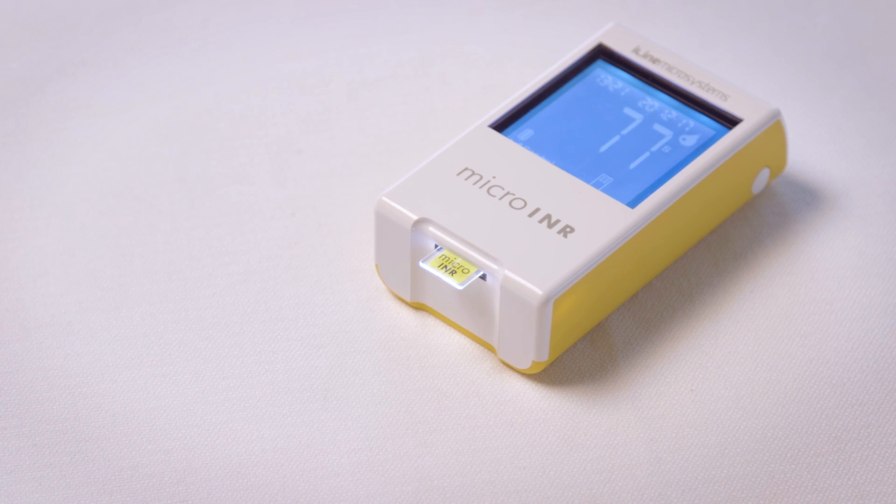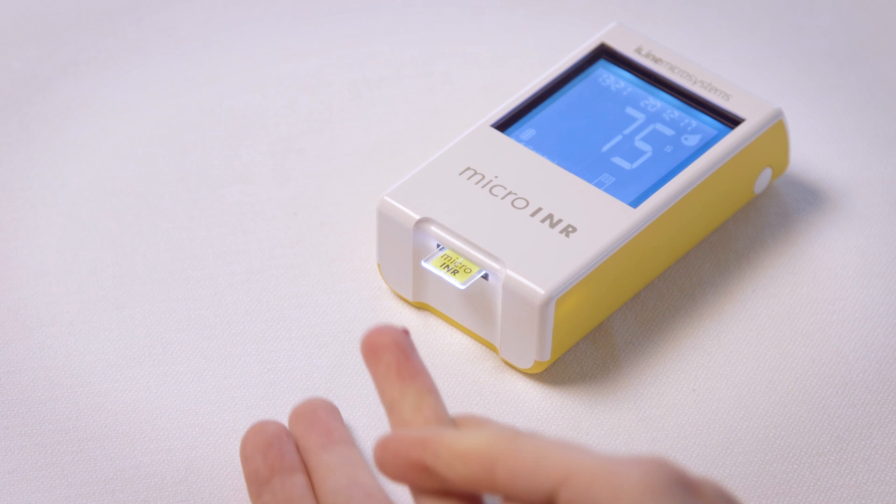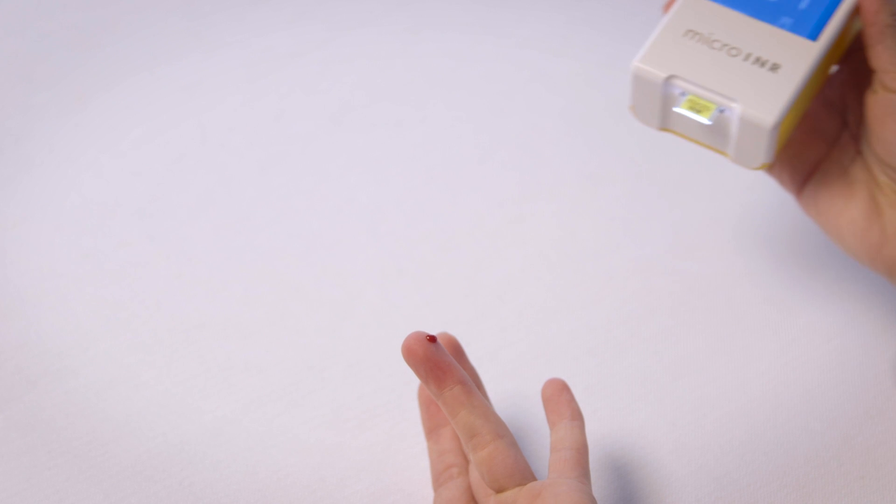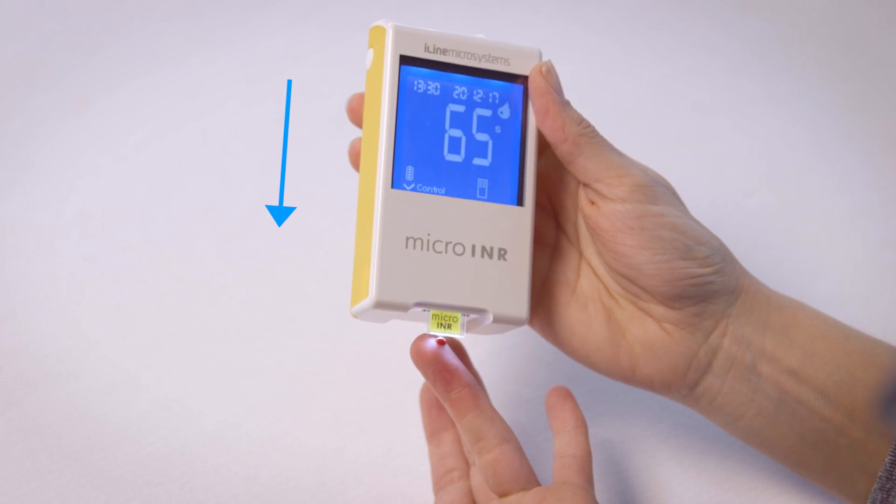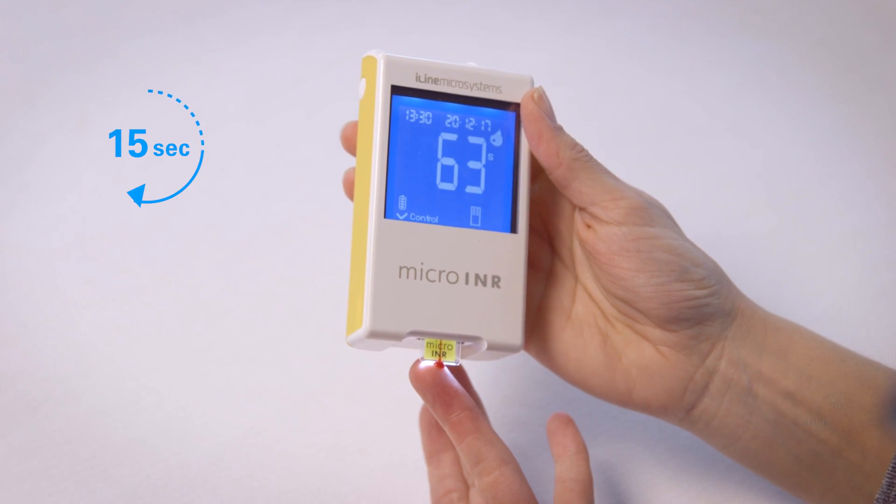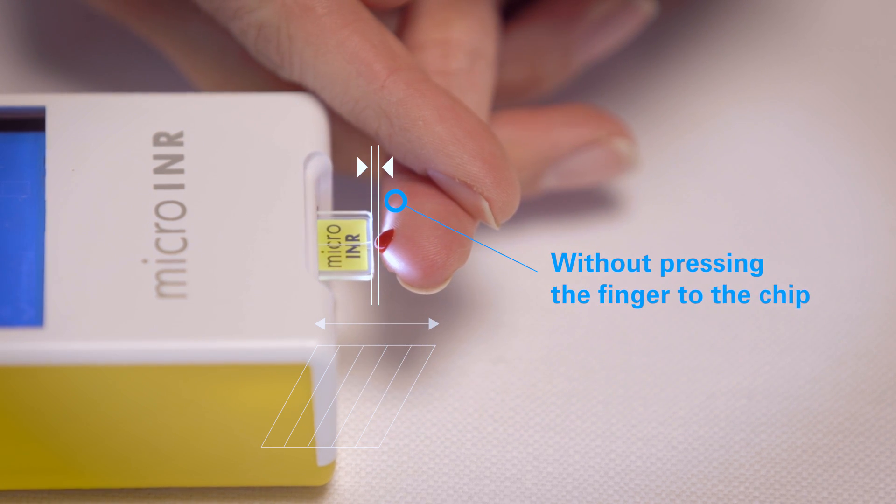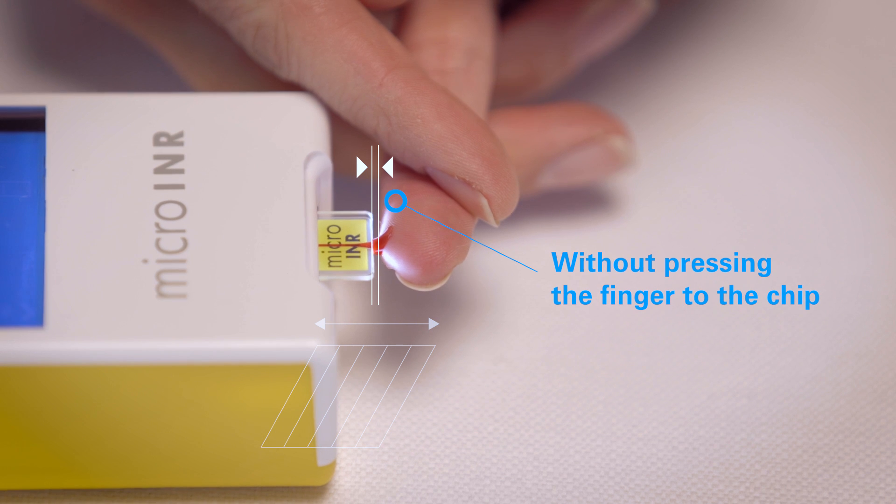Blood can be applied in two different ways. You can either move the finger to the meter or you can move the meter to the finger. Apply the blood drop immediately after finger prick without pressing the finger to the chip. Otherwise, the entrance is blocked and the blood can't be aspirated into the chip.